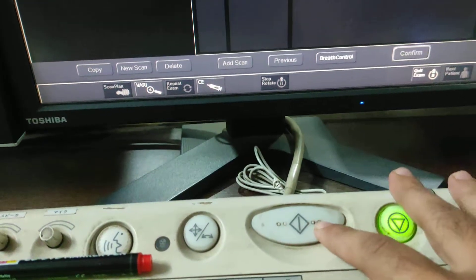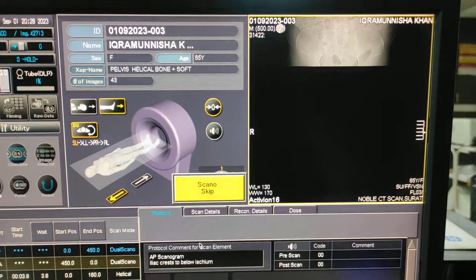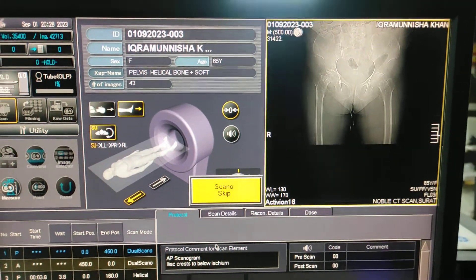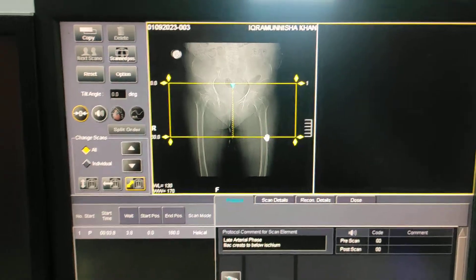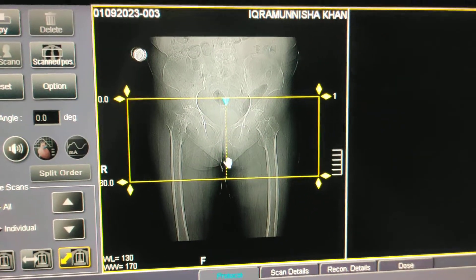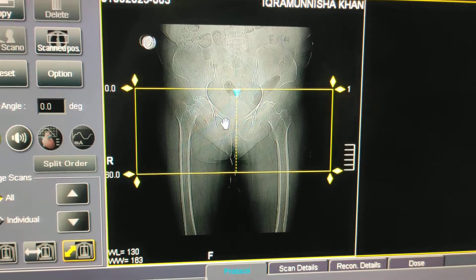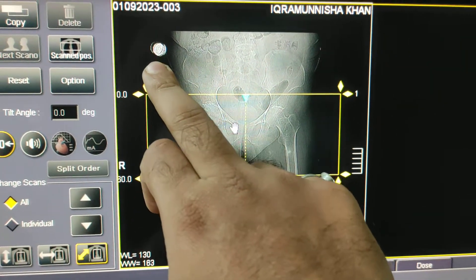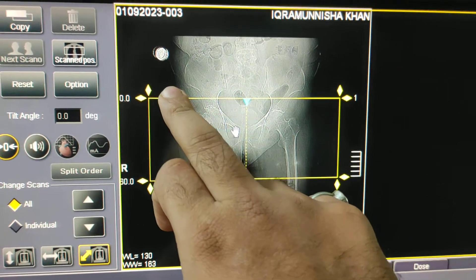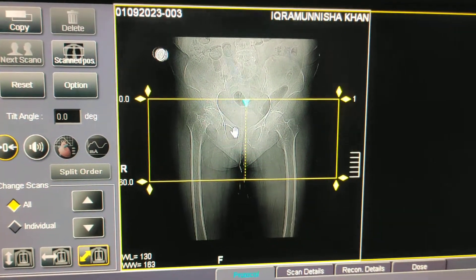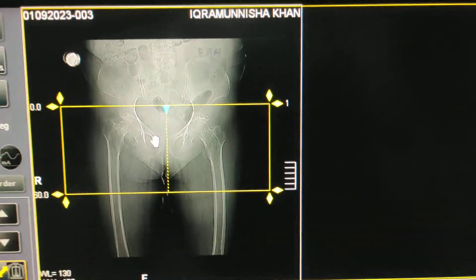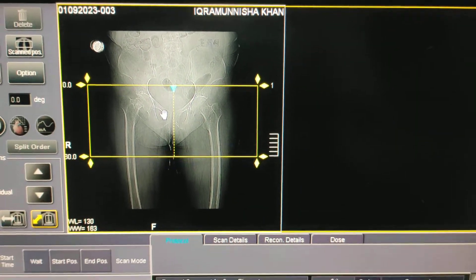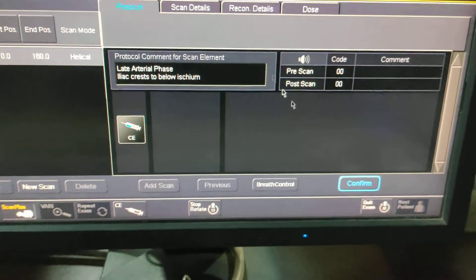You have to click one to two times to acquire the scanogram. Here is the AP scanogram. Some people take two scanograms — one AP and one lateral — but here I am taking only one. There is a coin or something in the image; I will ask the patient to remove it before scanning.